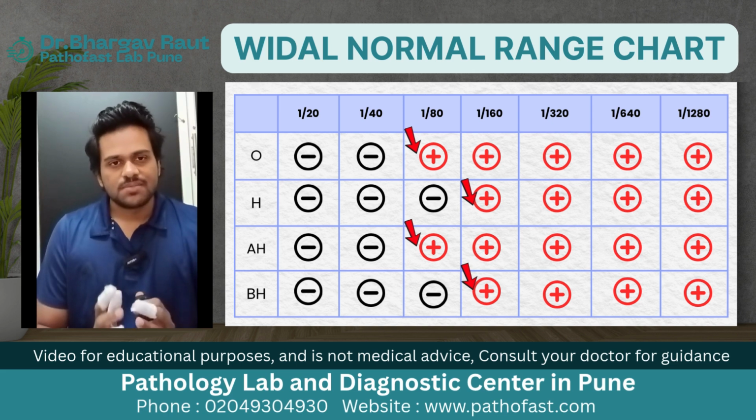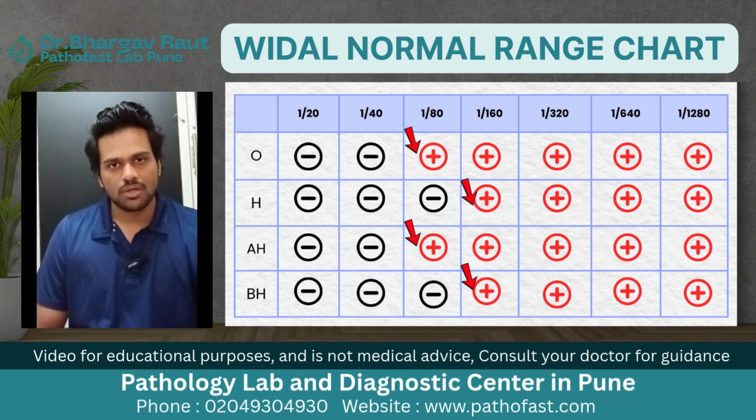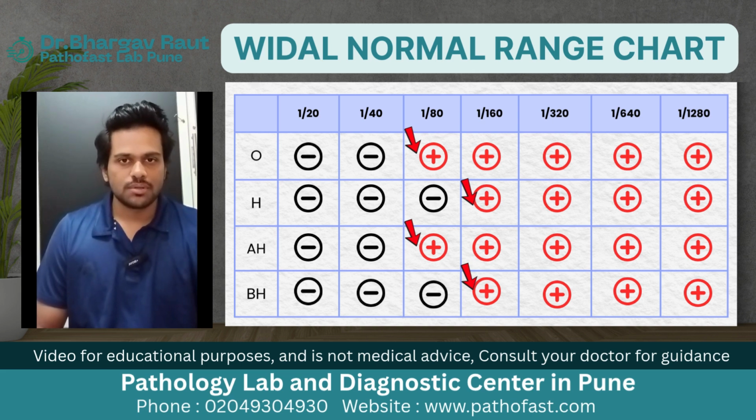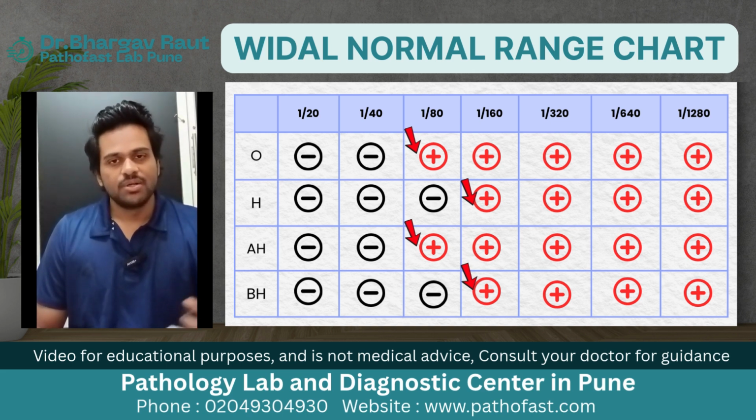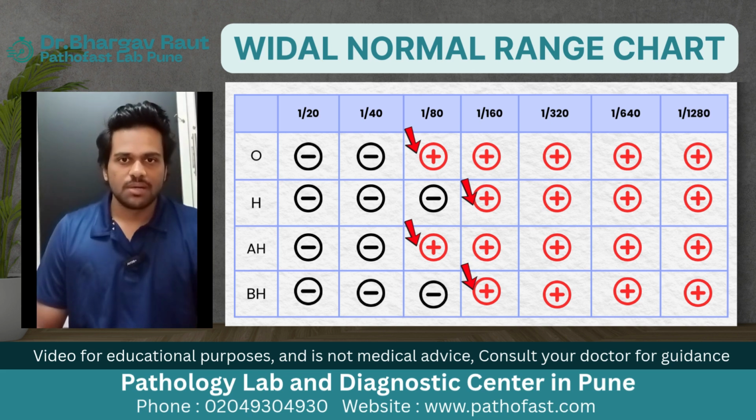So this is the cutoff that has been determined by checking what is the background level of antibodies in the population in India. I've set these cutoffs based on a study which was done in Mumbai, which is specific to the state that we are in. So anything more than 1 divided by 80. So let's say that we find the titer. The first time we find it positive, it is at 1:80. We find it positive. It may then be positive even at 1:160, but maybe by 1:320 we don't find it positive anymore, because by then it has been diluted a lot. So the cutoff to decide is 1 by 80. As long as 1 by 80 is positive, we call it positive.